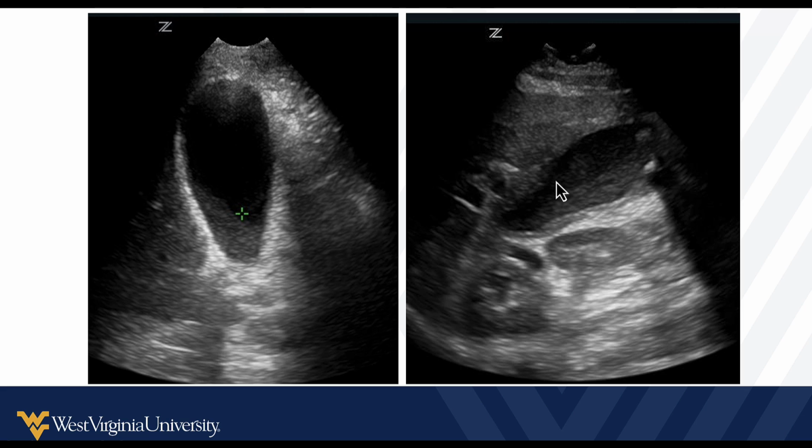In this example here, we see this gray dependent sludge. We don't see shadowing from it, although there does appear to be a stone up here in this gallbladder fundus with a deep dark shadow. The wall is a little poorly defined here. Not sure if that's just a bad slice. You definitely want to look through there and fan through that a little bit more to see if that really looks like a thickened wall in that gallbladder or not.